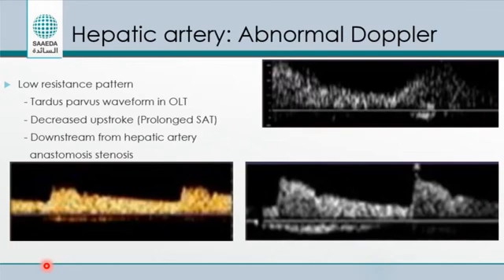The origin, the stem of the hepatic artery. This is in liver transplant. It's very important to be noticed.